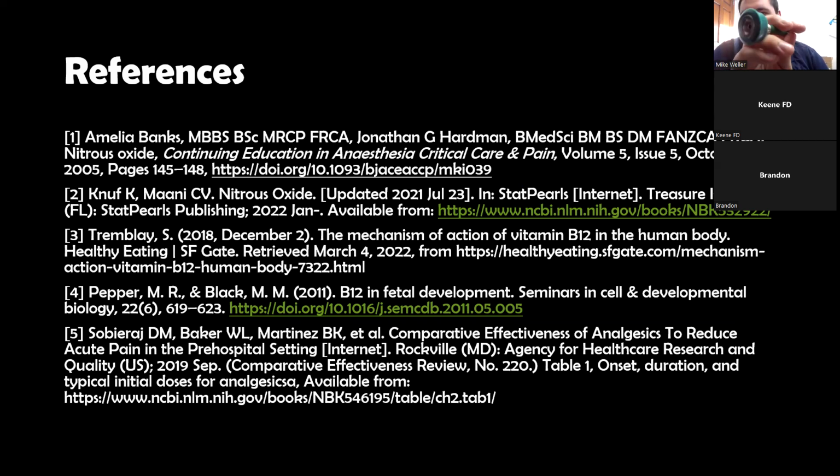is that this is the connector, okay? It's a screw connector to oxygen. So if you're gonna be running this off of oxygen tanks, you know, the little portable oxygen tanks, you're gonna need to make sure that you have a regulator that has a screw on it. So you're gonna want one of these screw male adapters on your regulator when you do it.